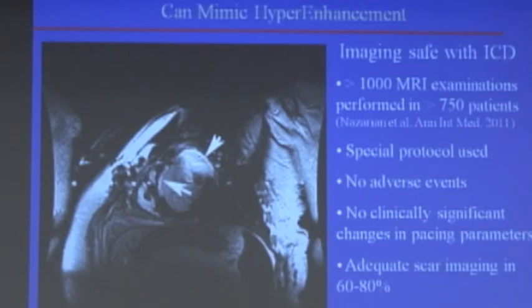Interestingly, there is some MR physics that allows you to get rid of this artifact, but that's still under development. As time goes on, the FDA prohibition, if you will, or at least the contraindication that's there now, probably will disappear, because the companies are really seeing that MR imaging is becoming more and more important, and the companies are coming out with MRI conditional devices.